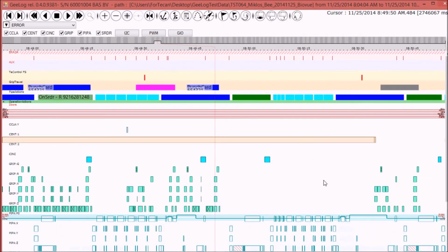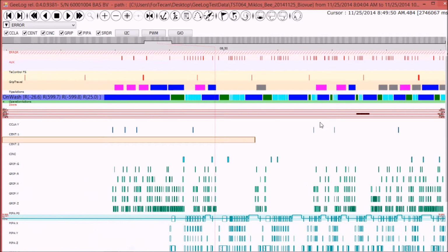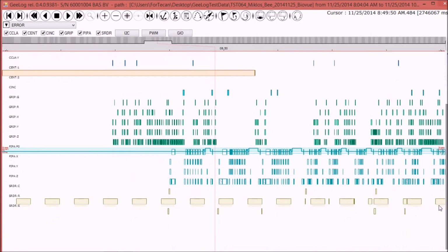Of course, besides these kinematic moves, there are additional information. For instance, this is the so-called door locks. This instrument has a number of doors which can be opened, and there are specific sensors that show if the door has been opened or not. There are other kinds of stripes representing other different contemporaneous activities being carried on by the instrument itself. It is possible to show even data measured by the instrument.